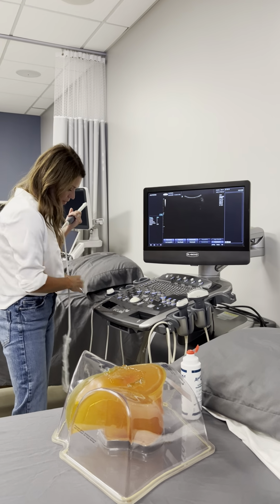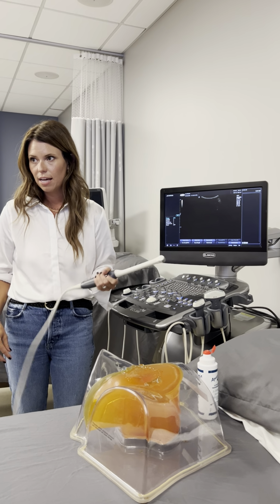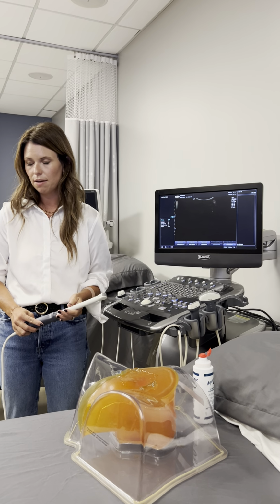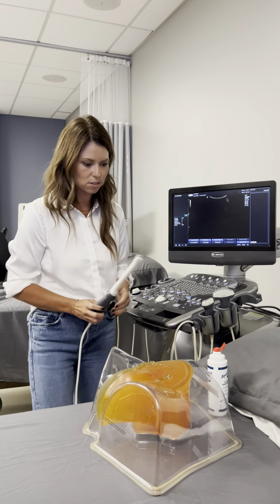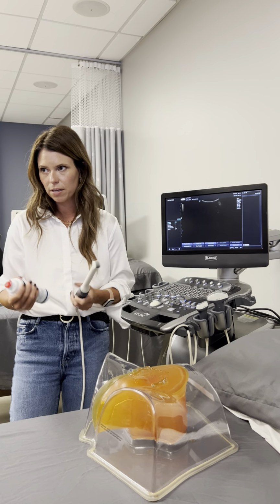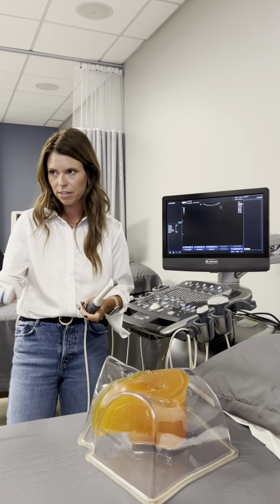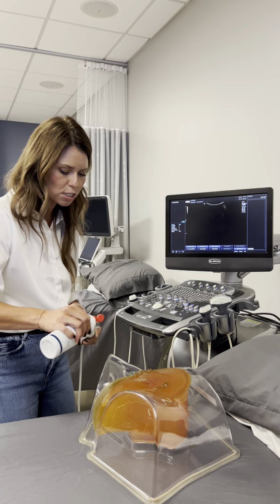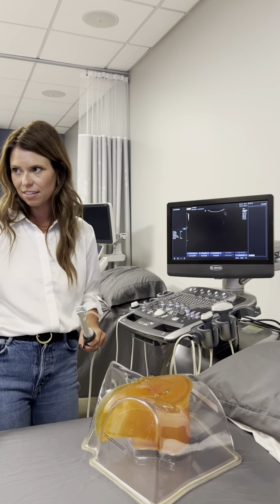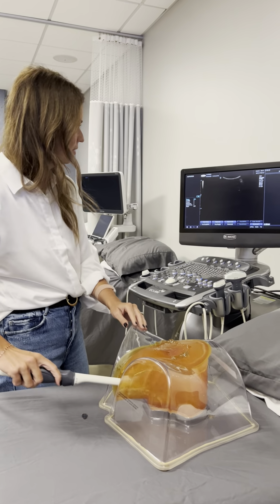Okay, where you really like to go, and where we can't practice in lab, and so you'll be learning a lot in clinicals, where everybody gets enough practice and they do really well, is the transvaginal. You will have a sterile cover, of course, with lubrication on that and gel, which helps us transmit the sound. It's not necessarily sterile, but we keep it as sterile as we can. Does that make sense? Okay, so here we go.